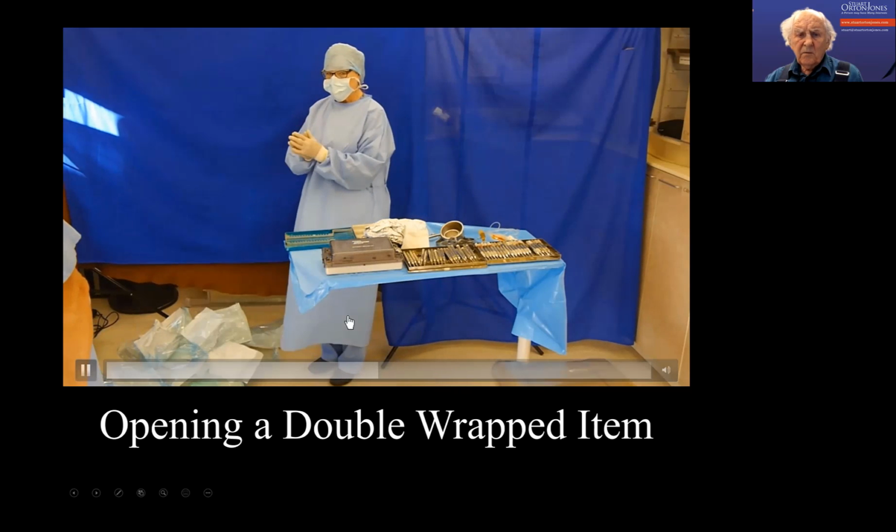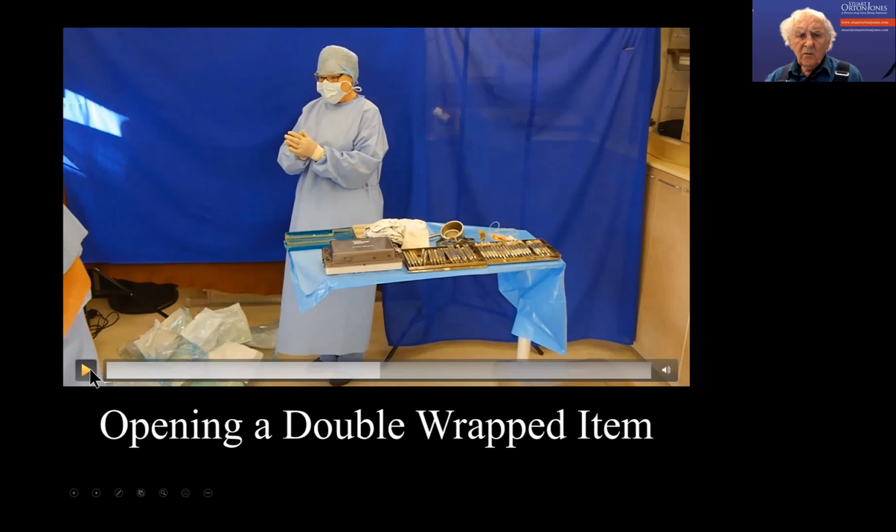That's the tubing, the saline tubing that goes to the motor from the bag of saline.